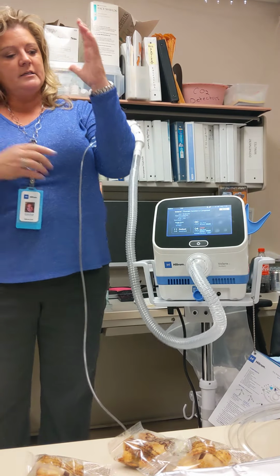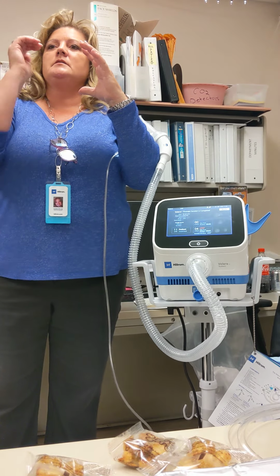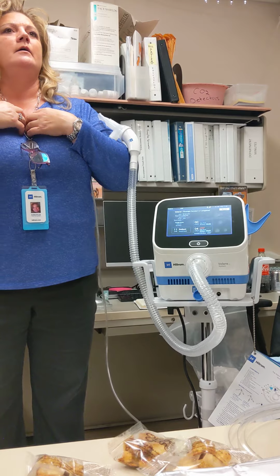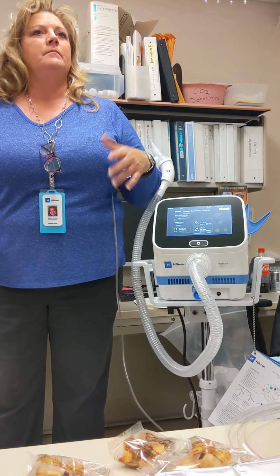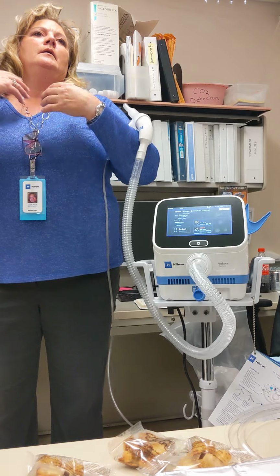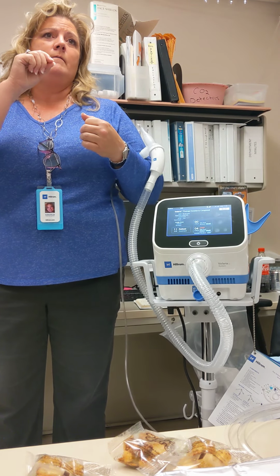We have lung expansion, opening up the airway, and then the oscillation goes behind those mucus plugs and brings it up to the bronchi. Now, if we go, okay, treatment's done, bye, what's going to happen? Gravity. It's going to go right back down, and we defeated the whole purpose. So have them cough, have them try to get something out, even if it's very small.